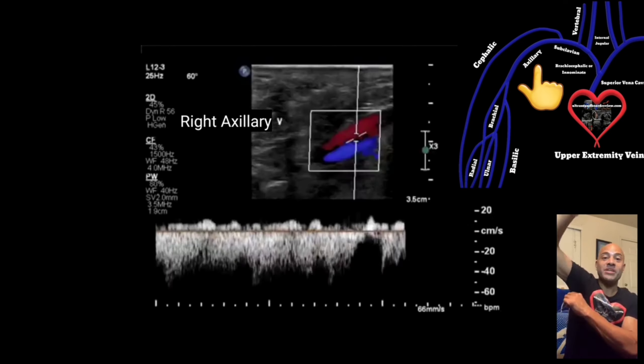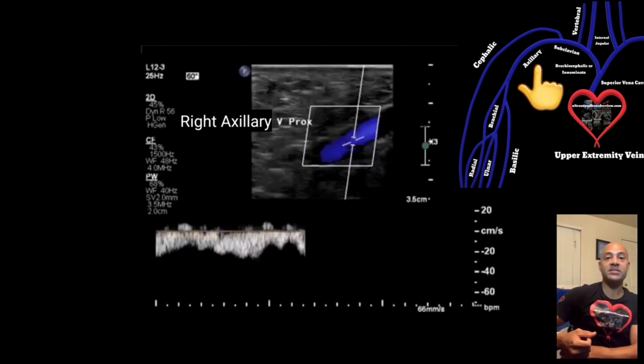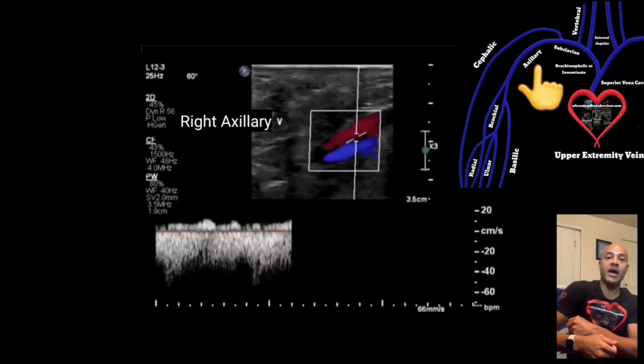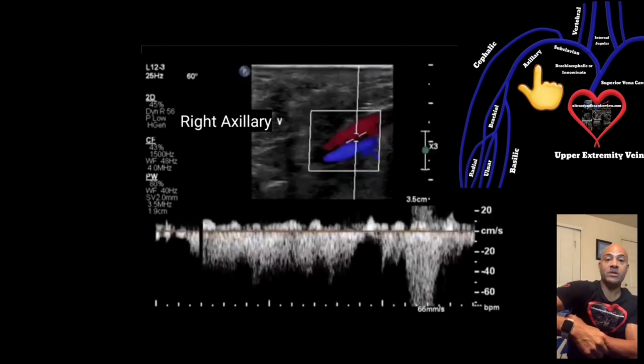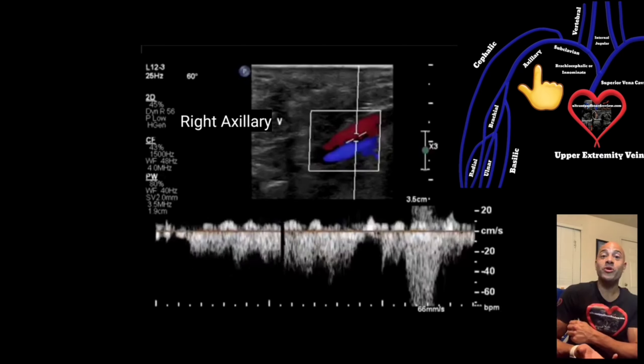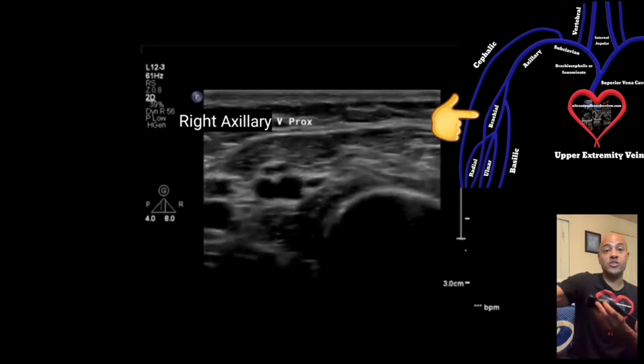Sometimes if the patient can't lift their arm, you'll need to tuck your transducer in between the patient's arm and thorax and push up. Make sure you're using plenty of gel and maneuver around until you find it. Turn on color, because color Doppler will be your best friend in this scenario.